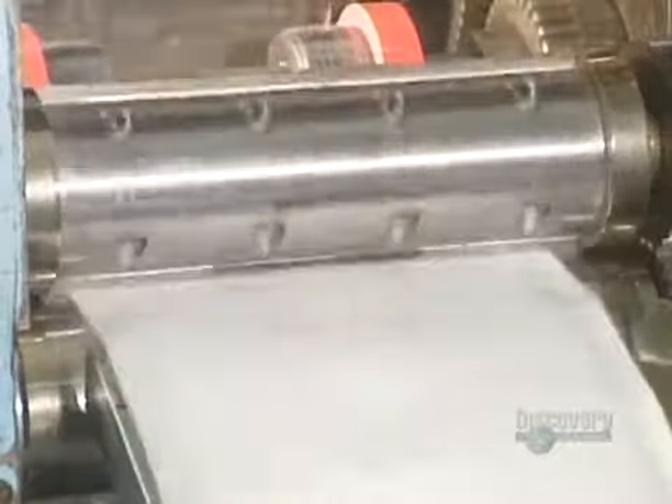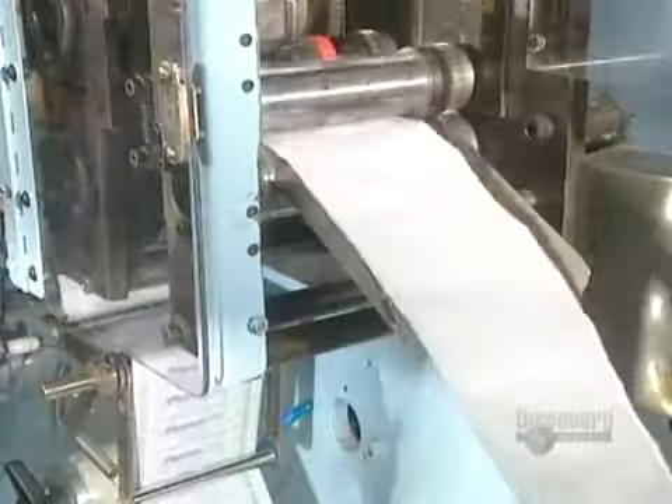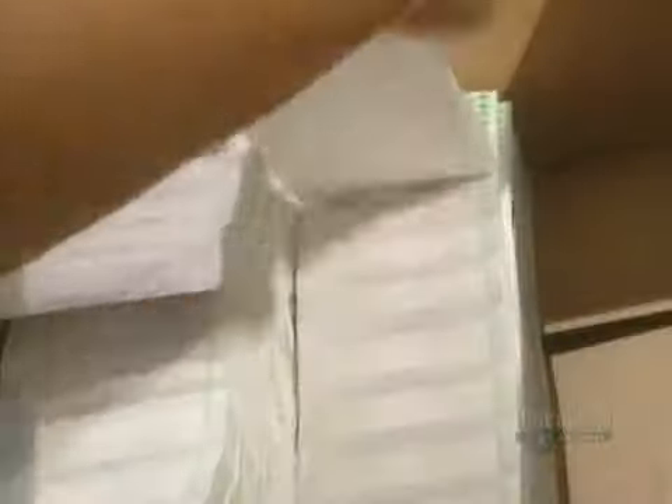This roller perforates holes which will allow the bandages to be easily separated from one another. Strips of bandages are then placed into boxes.